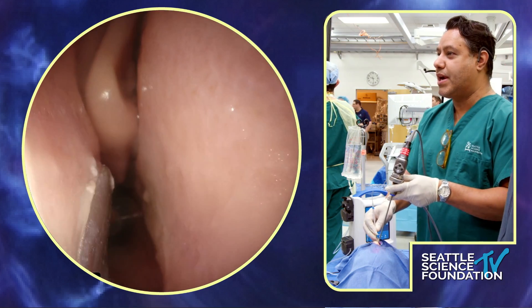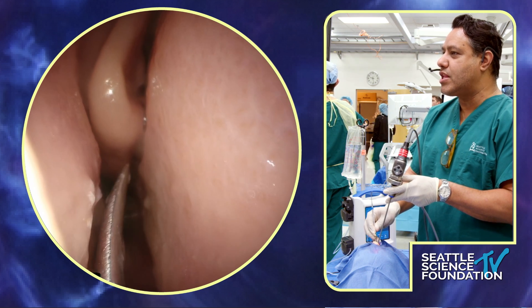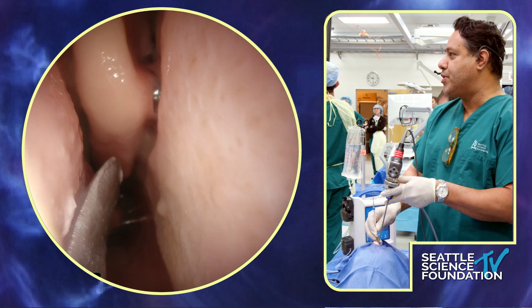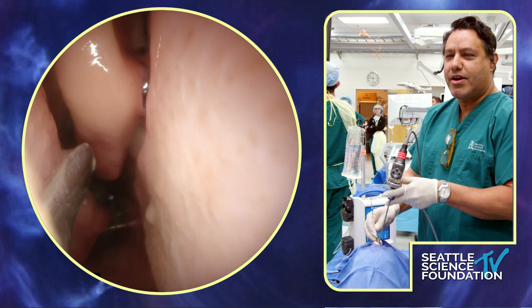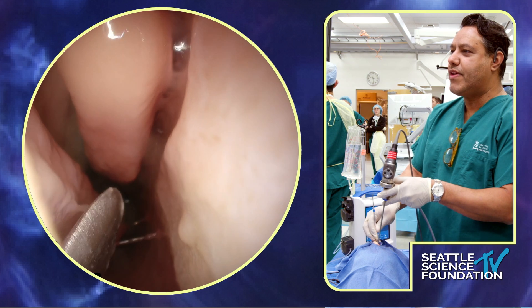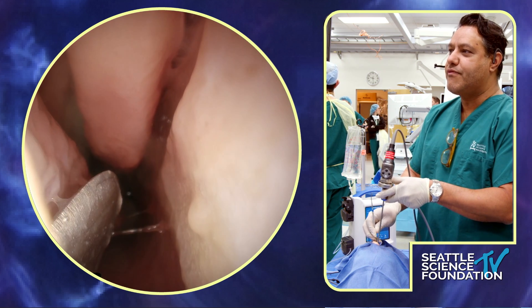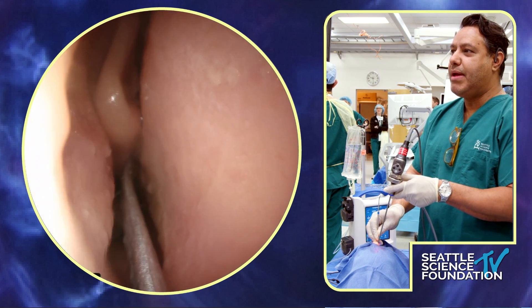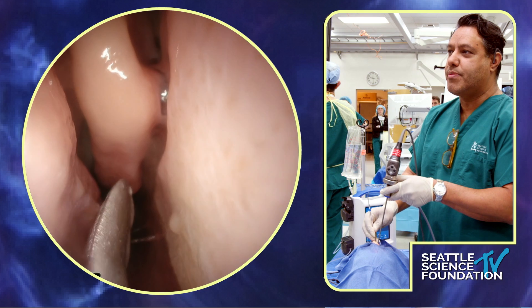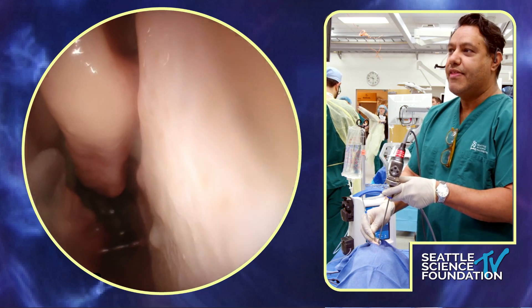My technique for inferior turbinate outfracturing: we begin sinus surgery or any nasal surgery by outfracturing both inferior turbinates. I use a Boise elevator — it's a little heavier. The only tip I have is make sure you can see the tip of your instrument. I follow it down all the way posteriorly and outfracture a little bit up front, then go right to the back. What this allows me to do is appreciate the anatomy of the tip of my instrument relative to the middle turbinate, so I don't inadvertently grab the middle turbinate and outfracture that as well. By keeping the free edge of your Boise above the attachment point, you won't skive into it and cause bleeding.